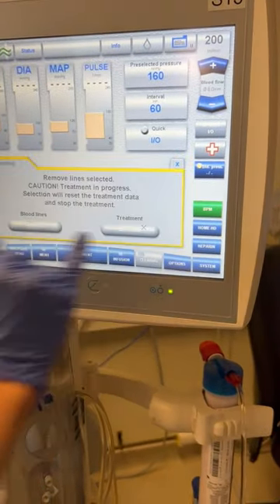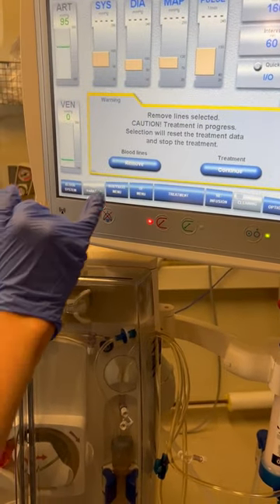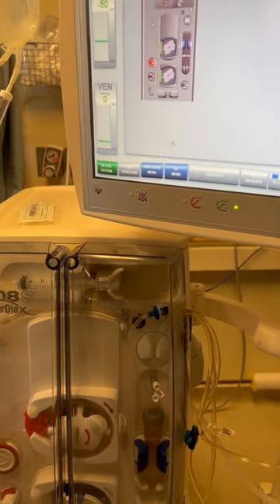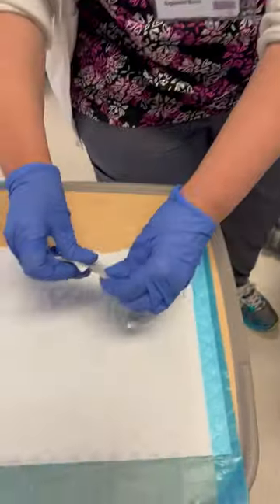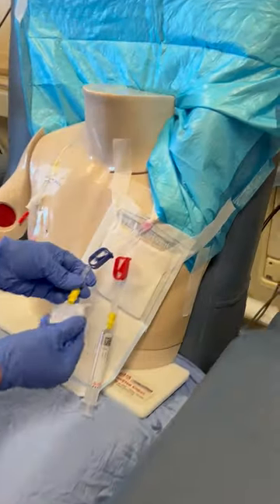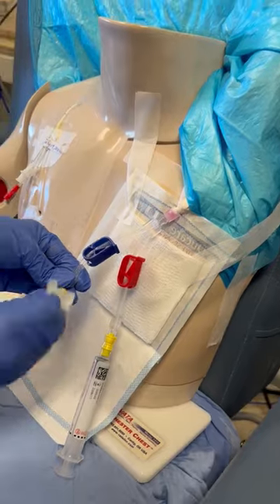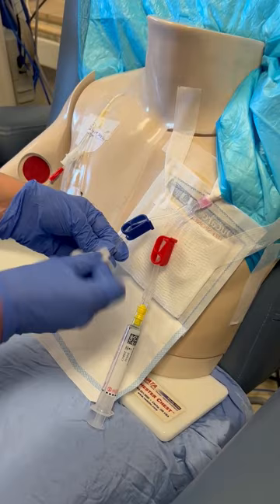Once the machine doors are closed, go ahead and hit remove bloodlines. We're just going to remove the bloodlines, then go back and finish off our venous lumen. Opening our other chlorhexidine gluconate swab, scrub the tip of the tego — 30 friction scrubs.